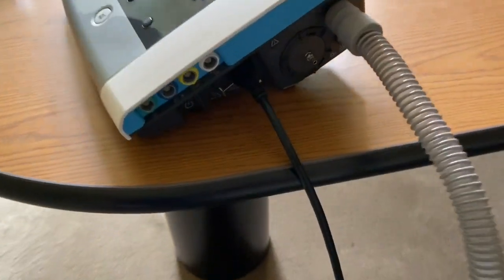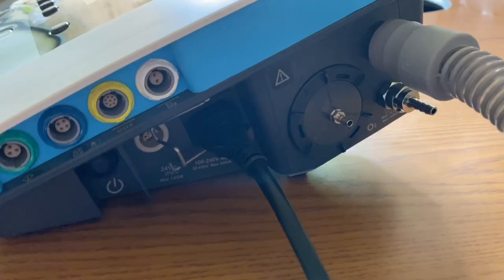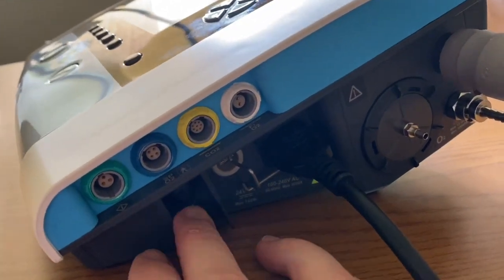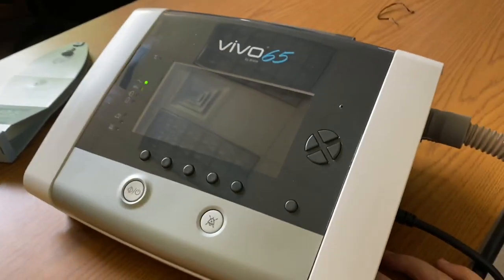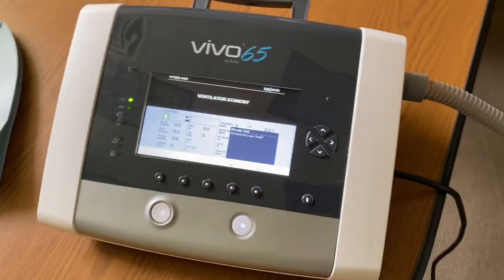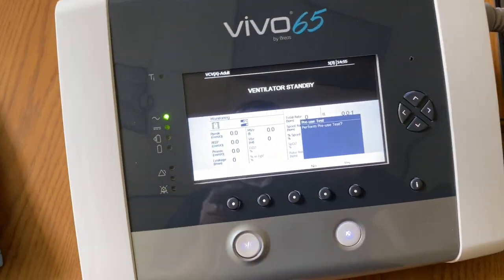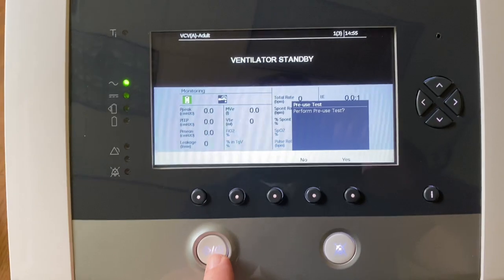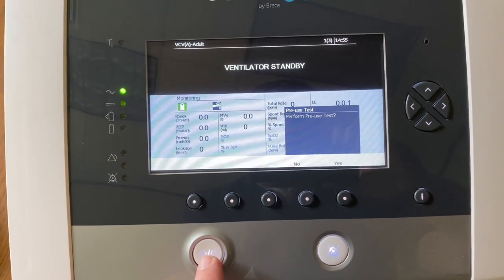To wake up the ventilator and power it on, you first have to wake up the screen. There's a power button on the side right here that, when pressed, will wake up the screen. It's currently in standby mode. To actually power on the ventilator, you would press and hold the power button.